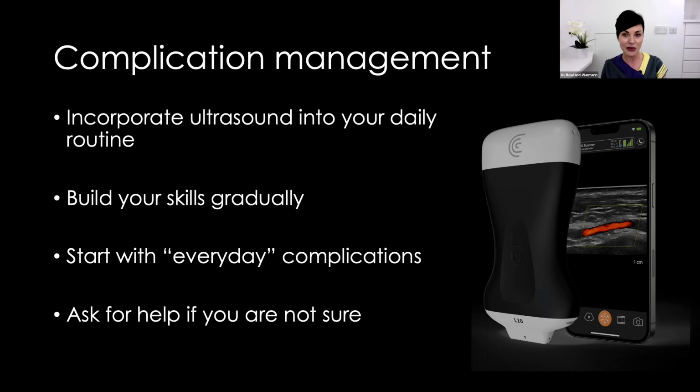If you're starting with complications, choose the everyday ones. Simple, guided hyaluronidase in patients who aren't too concerned or where misplaced filler is maybe an incidental finding. Like lips and easily identifiable filler in cheeks is great. This way, you can eliminate unpredictability in high-risk procedures by doing low-risk treatments with ease.